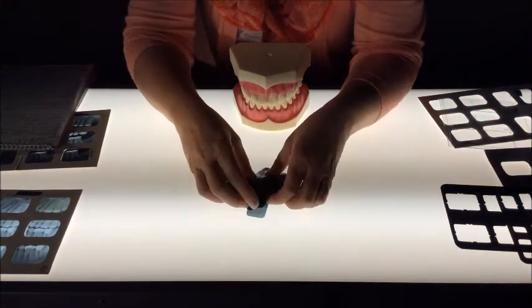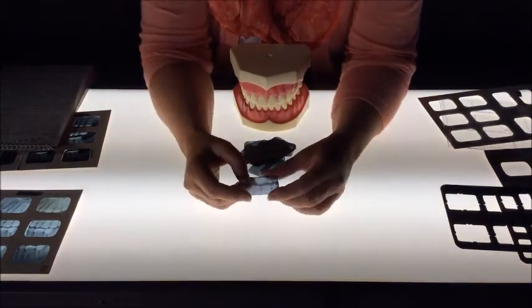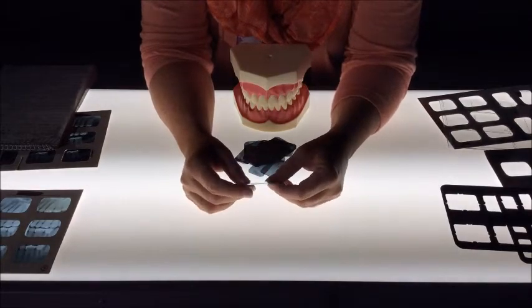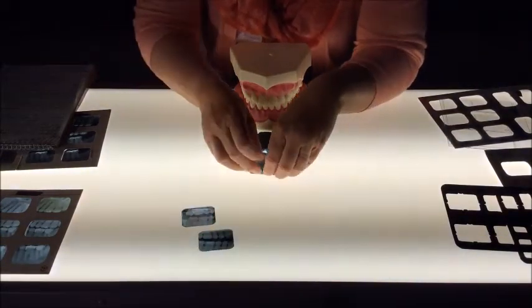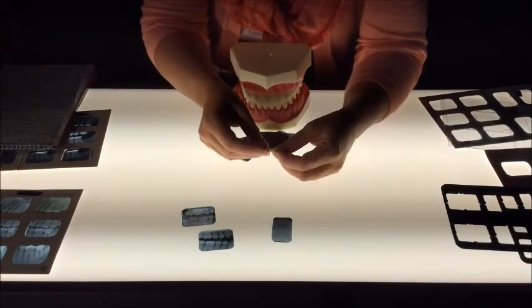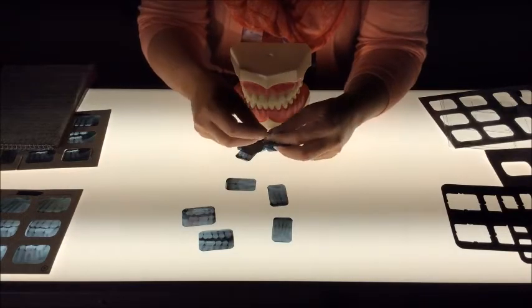And that's the first thing we would do. It's kind of like a jigsaw puzzle. The first thing you would do is orientate to get all of the puzzle, the colored features up. And we're doing the same thing here. Think of it, we want that identification dot up. So feel for that identification dot. Make sure that it's up. That's the first thing you want to do with all of your film before we do anything else.